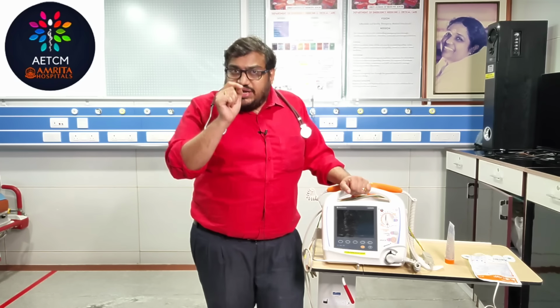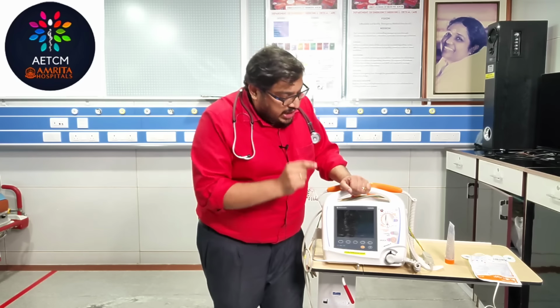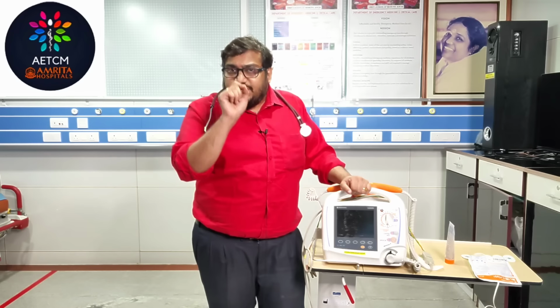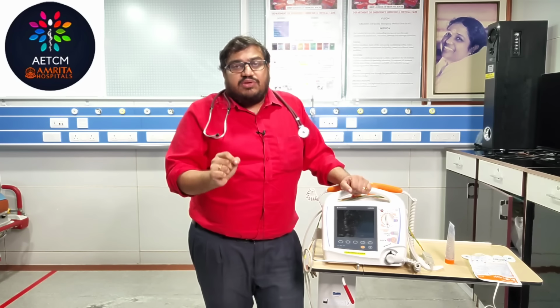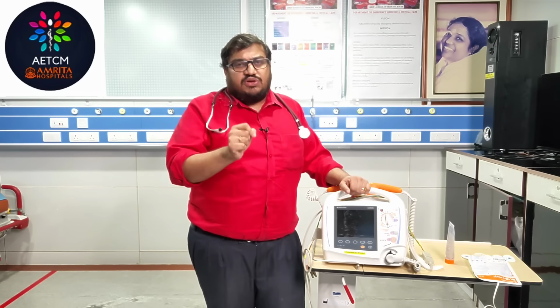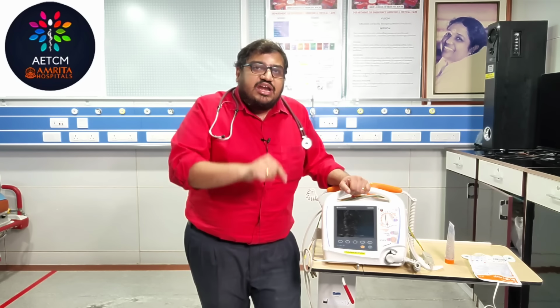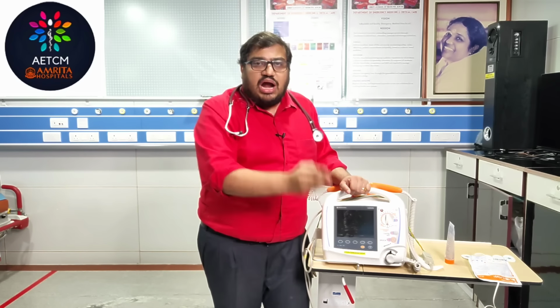So while you are delivering the shock for a cardioversion, you have to make sure that you are selecting the energy, and also in your defibrillator you have to select the synchronized button, press that button and deliver the shock. At the time of delivering the shock, you need to hold it for a fraction of a second more, maybe 1 or 2 seconds, because the machine needs to identify the peak of the R wave and deliver the shock at that point.